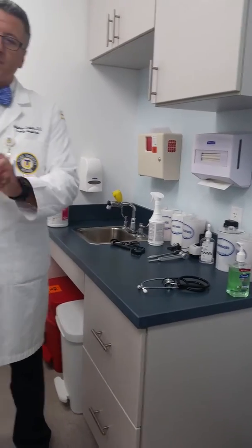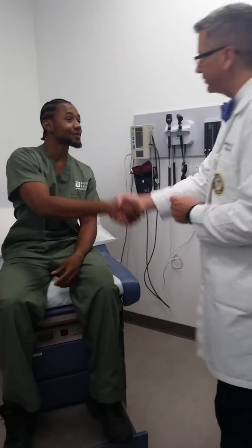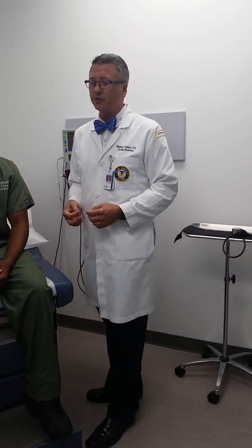The first skill we're going to approach is doing the pulse. When you go into the room you want to make sure that you have either applied hand sanitizer or that you have washed your hands. You then go ahead and introduce yourself: 'Hi, Mr. Bolton is it? Yes. Dr. Carlson, it's a pleasure to meet you today. We're just going to check your vital signs really quick if that's okay.' Get consent for any procedure that you're going to do.